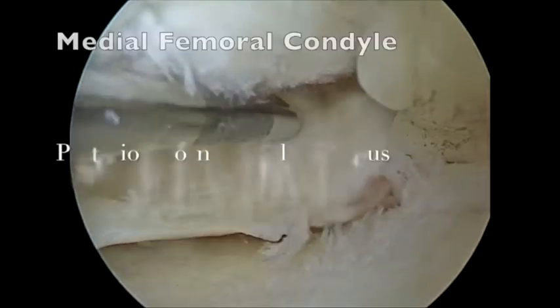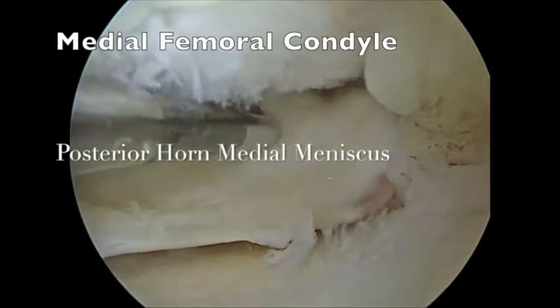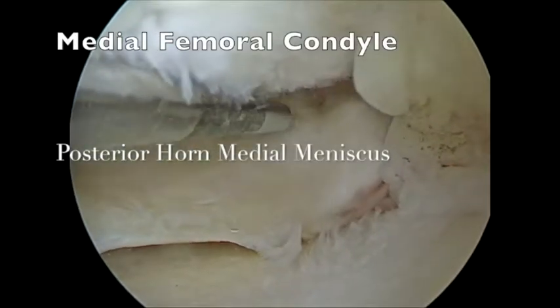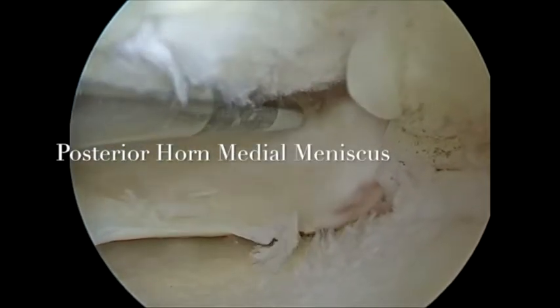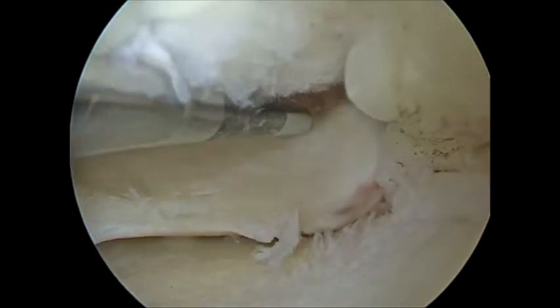The first part. Moving from the anterolateral portal, the probe was used to identify the torn medial meniscal root from the anteromedial portal.